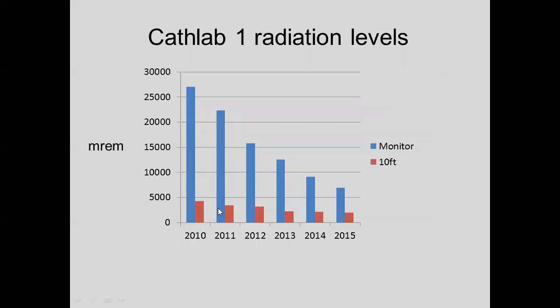Okay, cath lab radiation levels, and I thought this was very interesting. So we have a radiation area monitor right on our monitors in our cath lab 1, which is our highest used lab.